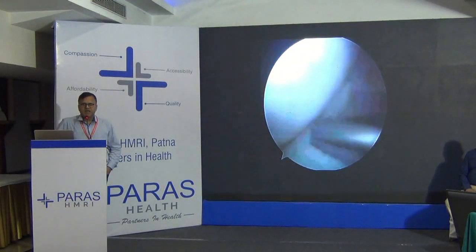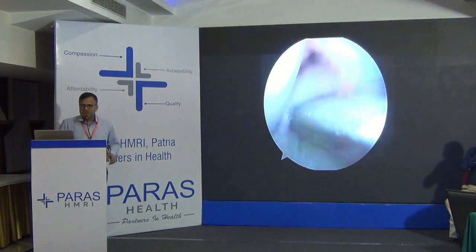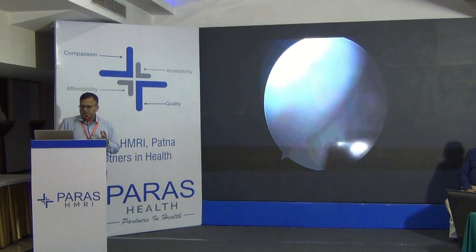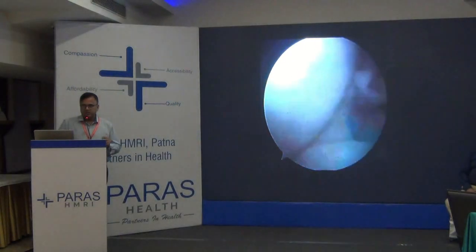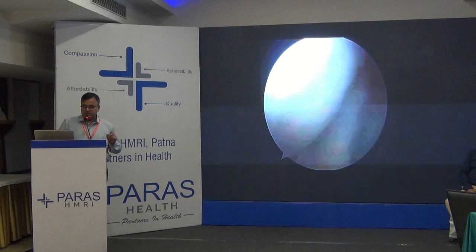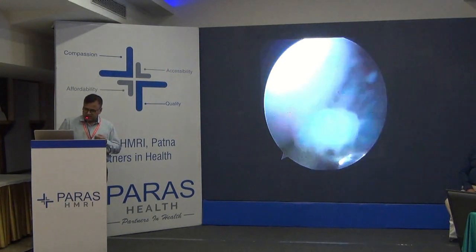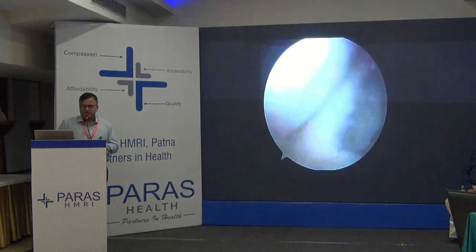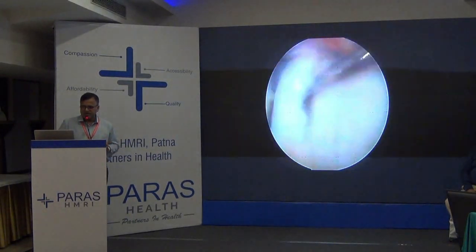It is a hectic process, we have to keep patience. Use the straight punch, backbiter, shaver, radio frequency and the probe. Simultaneously probing, cutting with the punch, and at the same time you use the probe to check the leaflet, the superior and the inferior leaflet.